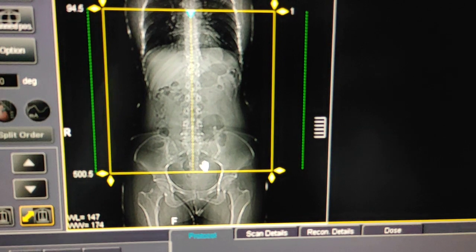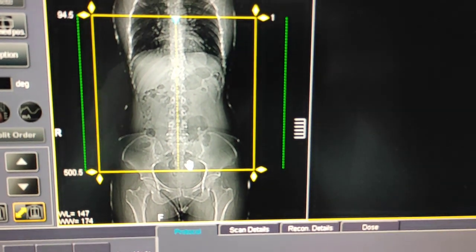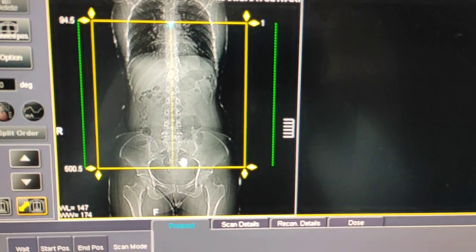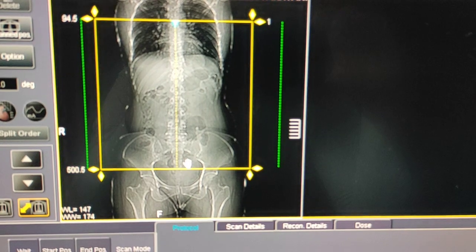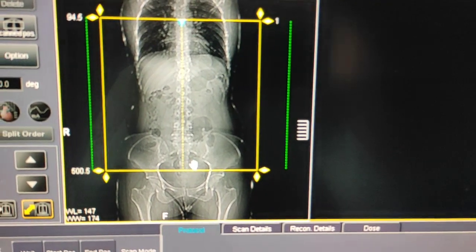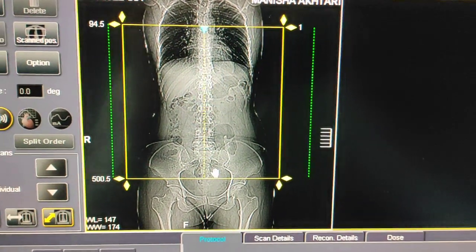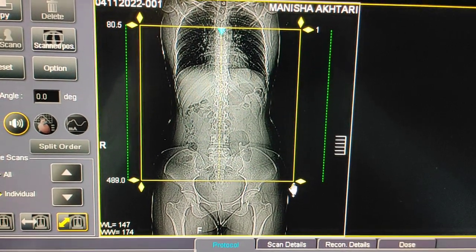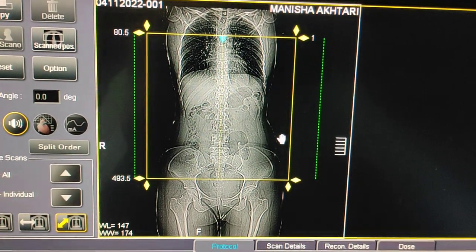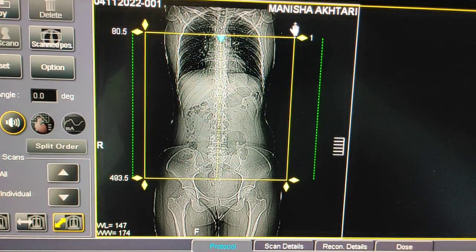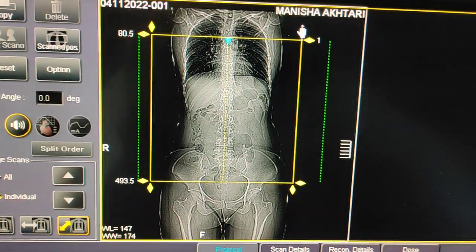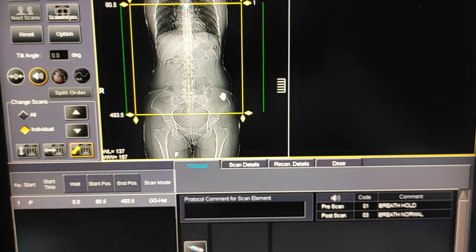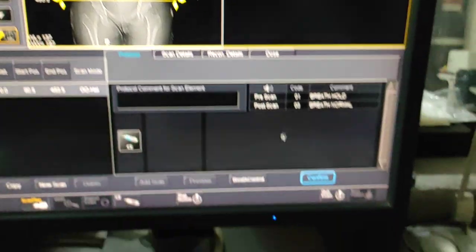The doctor asked me to take from D8, but otherwise for a standard dorsal lumbar spine CT scan you take from D10 to L5, which will cover the DL spine. So this is the plan — I am taking a few extra vertebrae. Nothing extra to do, just simply plan and confirm.